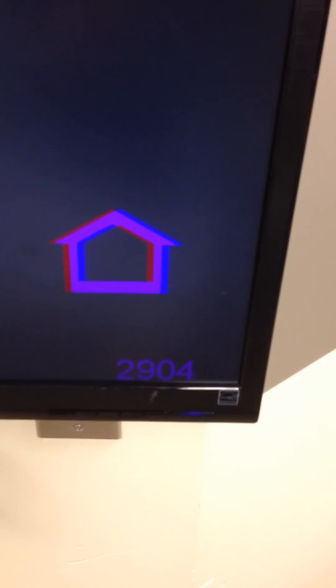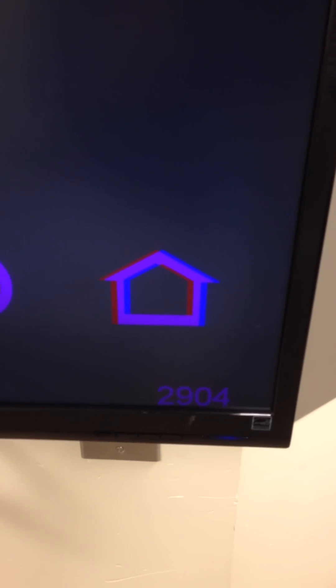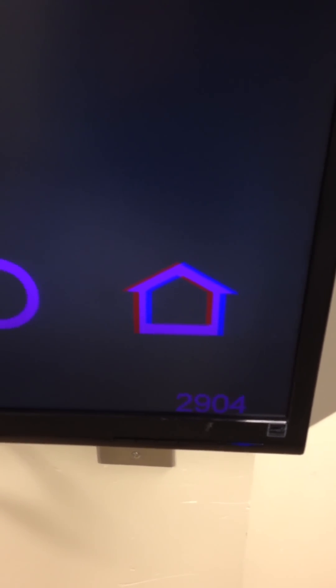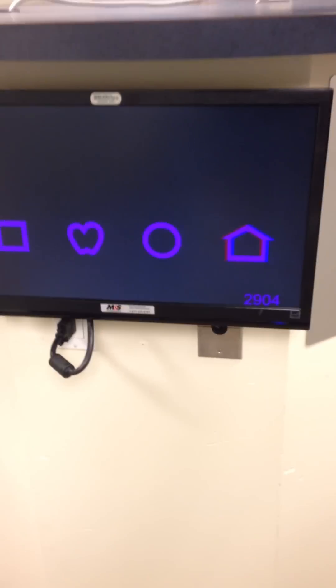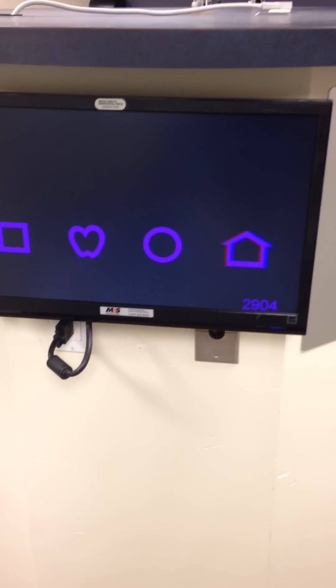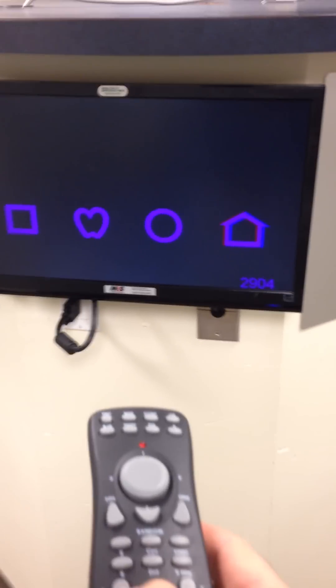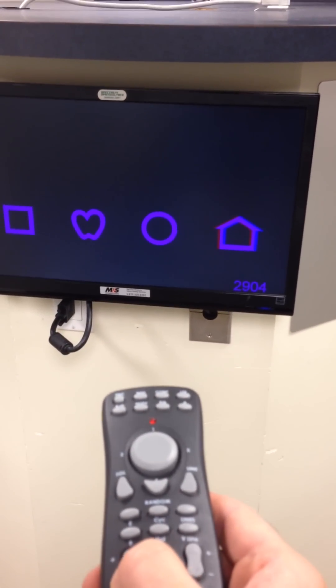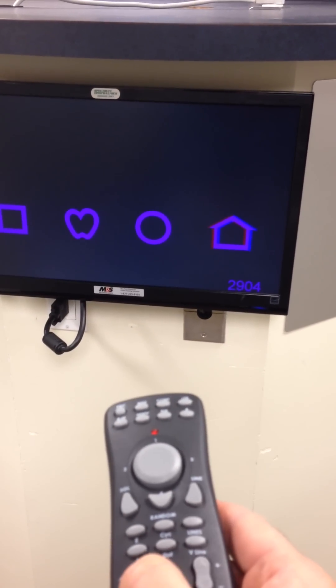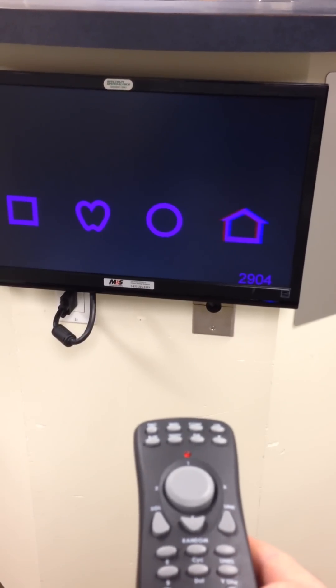And as you've learned in lab, that number of the first three digits is the stereo demand. The last digit, you might be able to tell what it is looking from here, but you don't want to tell your patient. And then using the up and down on the remote again, you can change the demand.